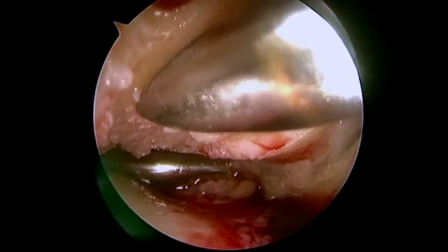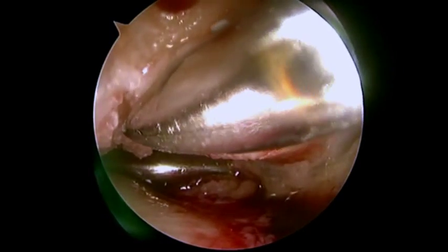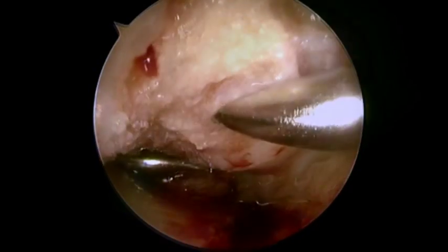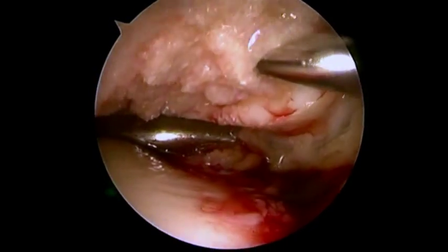The BioCartilage should be evenly distributed with no ridges. To help with evenly distributing the BioCartilage, you may use metal spatulas.